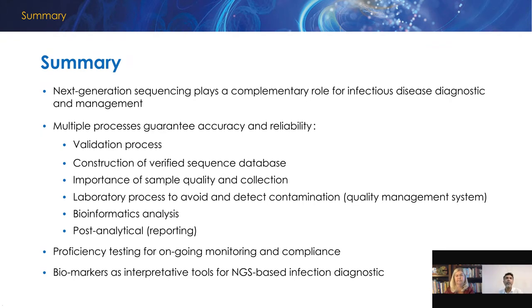Well, there are a lot of perspectives that have to be put together when the result is being evaluated for clinical utility. The test shouldn't be seen just as a result, and obviously the clinical management or treatment should not be based only on the NGS result. The clinical presentation of the patient is one, so the symptoms of the patient, how those symptoms match with the probability of infection, and with a probability of infection, what the NGS results actually show.